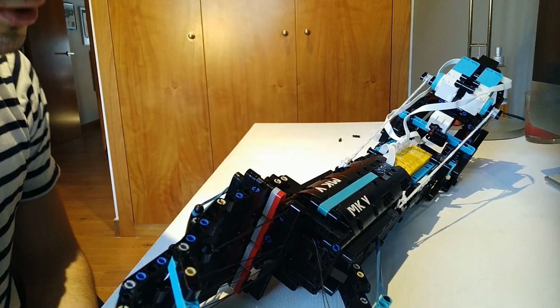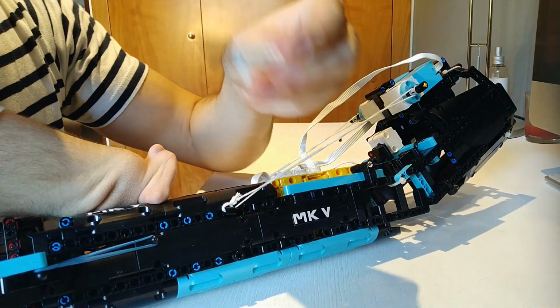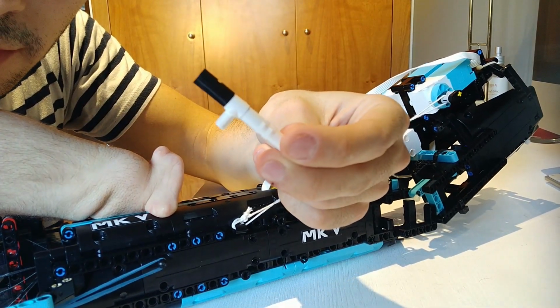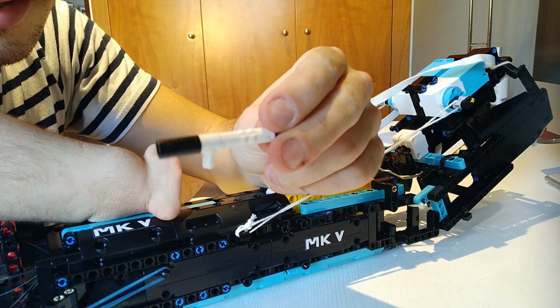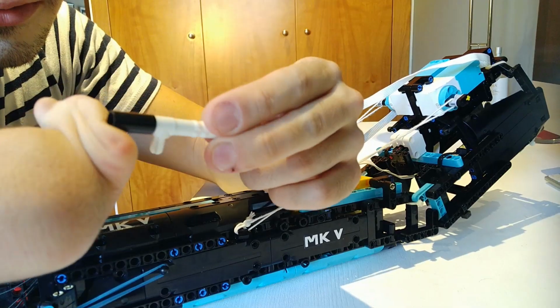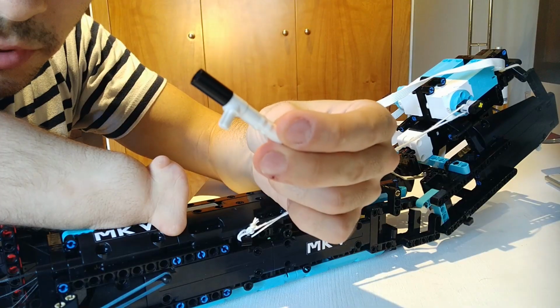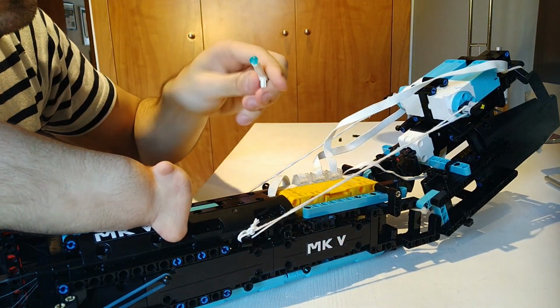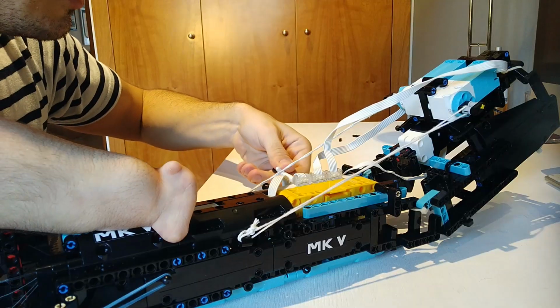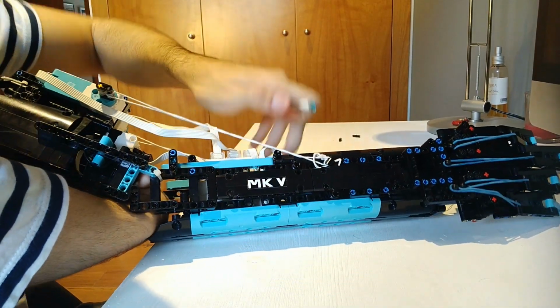Once you finish the prosthetic, you actually wonder, what's this brick for? You have this little brick right here on the instructions, and in the PDF you actually see this brick in black and white, so don't worry, it's the exact same thing. And the only purpose of this brick is to turn on the hub from the inside, so you don't need to pull the hub outside every single time you want to activate the prosthetic.